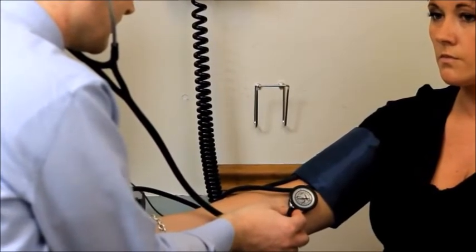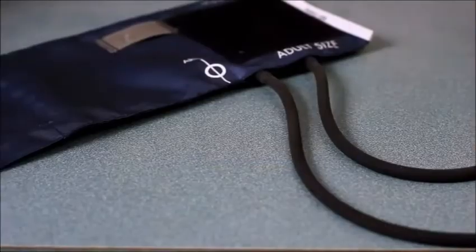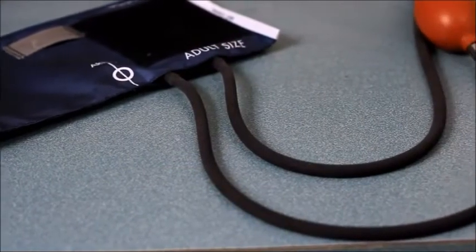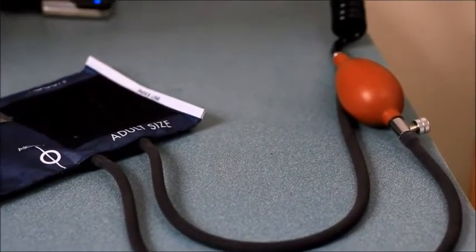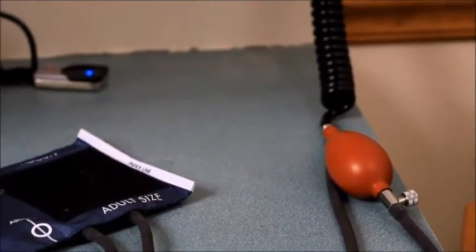The bell of the stethoscope should be used as it permits better auscultation of Korotkoff sounds. A sphygmomanometer consists of a blood pressure cuff containing a distensible bladder, a rubber bulb with an adjustable valve, and a flexible tubing. The tube connects to a manometer which measures the pressure within the cuff.